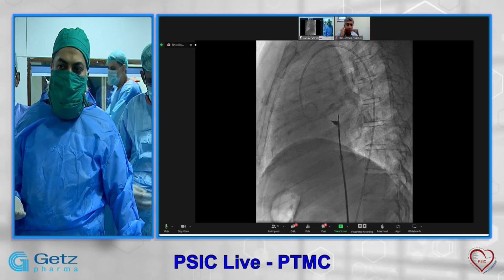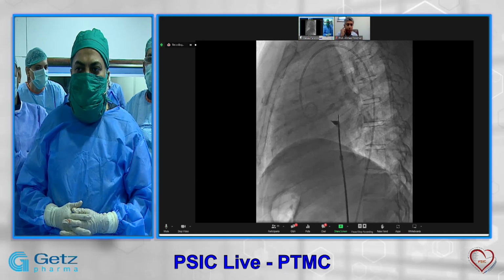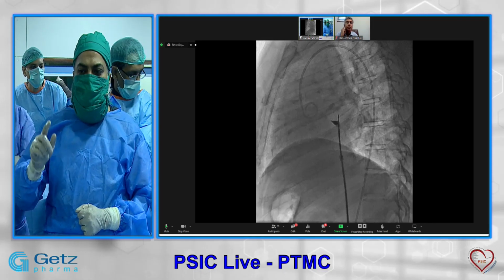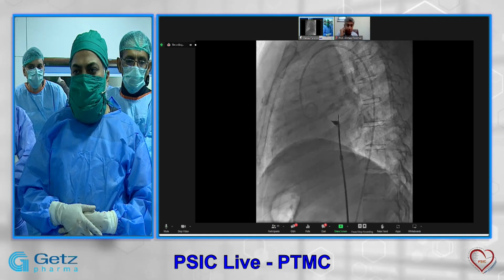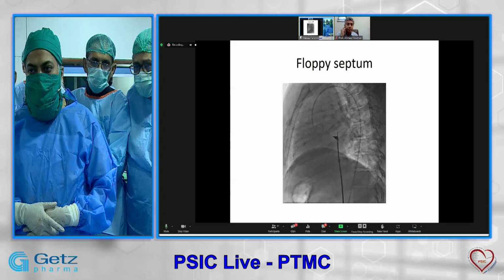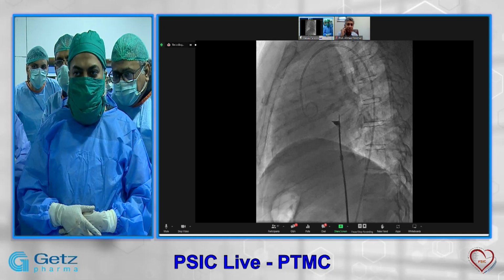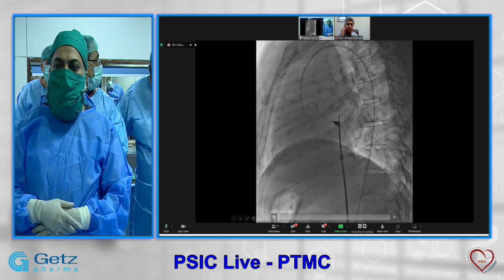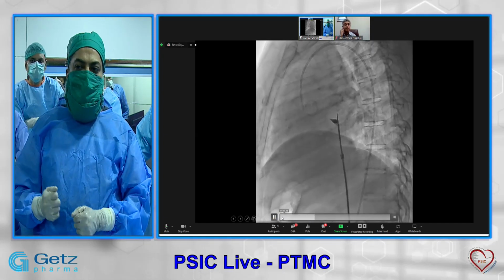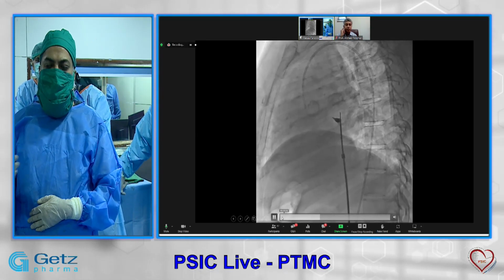But in Pakistan, we all know that we are used to doing these things under fluoroscopy. So what we do is we stain the septum, and just after the puncturing, we give the dye. Can you run this slide, please? Yes. 10 minutes. Okay. So this is an important thing you need to understand. You need to see the distance so that you will know how much further you can take your needle in if you have this floppy septum. Next, please.